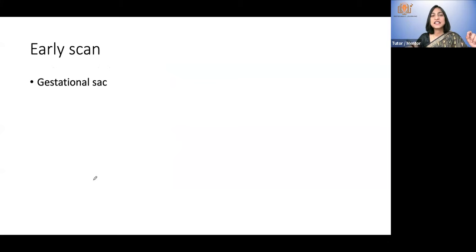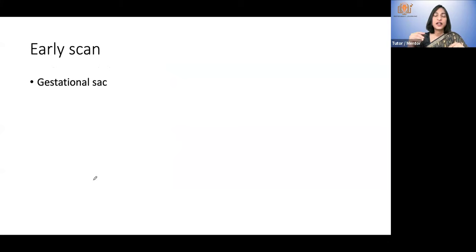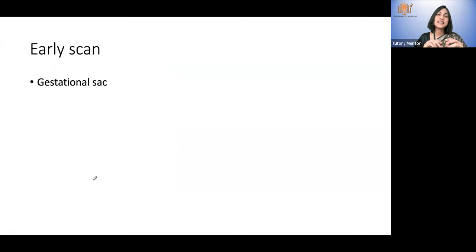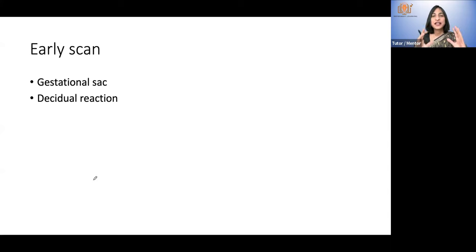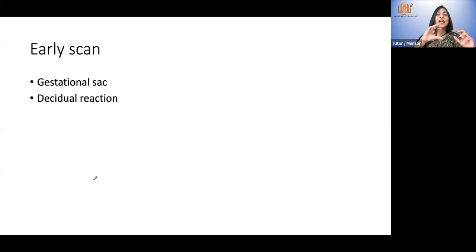A gestational sac. The gestational sac has fluid inside. Fluid on ultrasonography looks black or anechoic. So it is a circular ring-like structure with a black anechoic area inside, and outside it there is a hyperechoic white area which is the decidual reaction. This is also called the double decidual sac sign. Gestational sac is essentially a black circle with a white reaction around it.